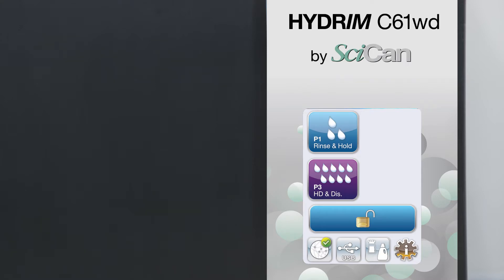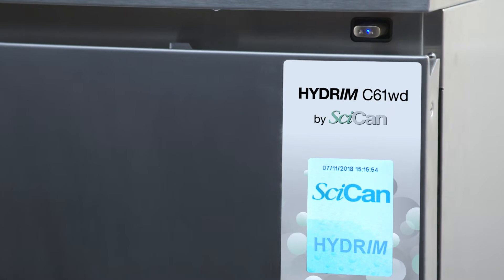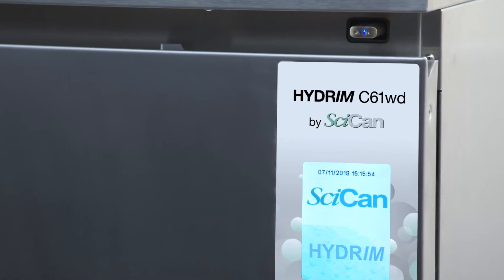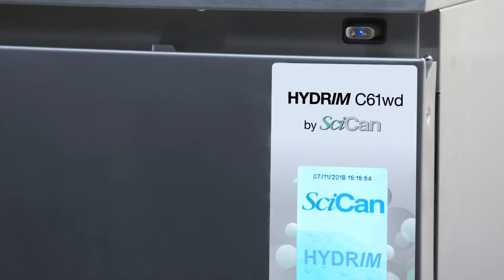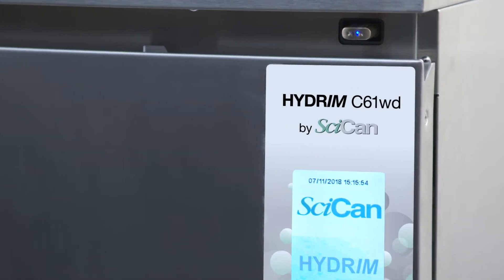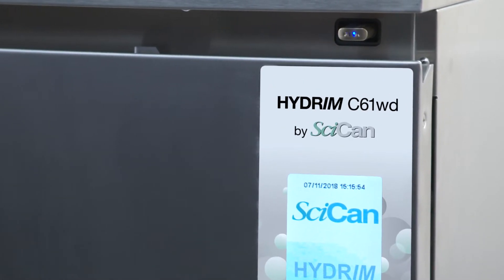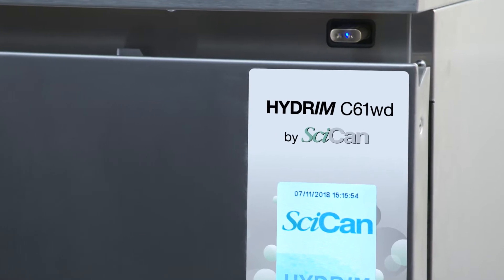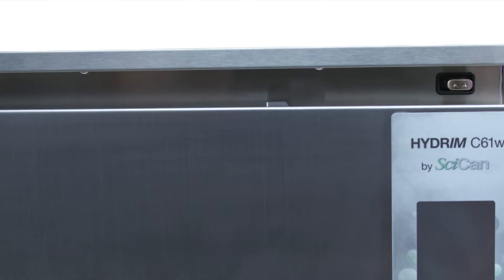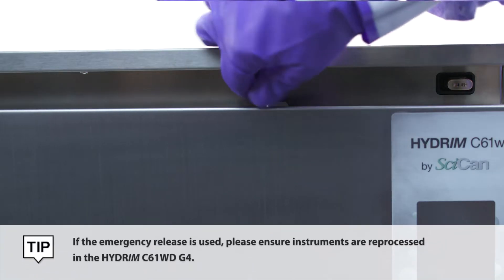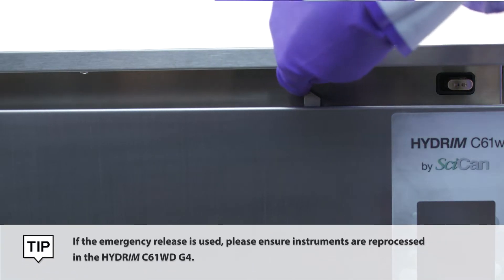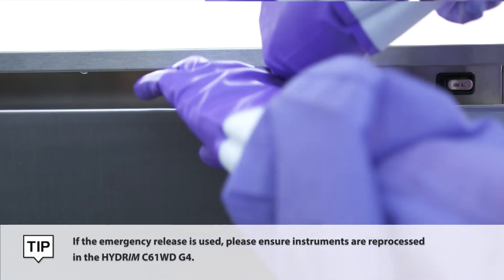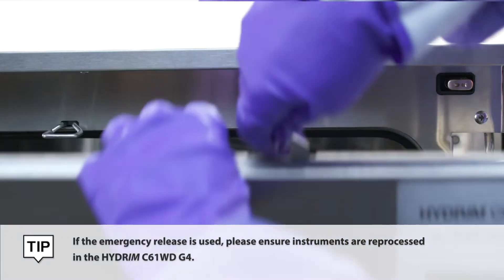Cycle data is automatically stored in the memory and can be accessed later. You can also copy the cycle data on a USB stick and transfer it to a computer for logging purposes. In case of a power outage, there is a manual release mechanism located on the top edge of the door.